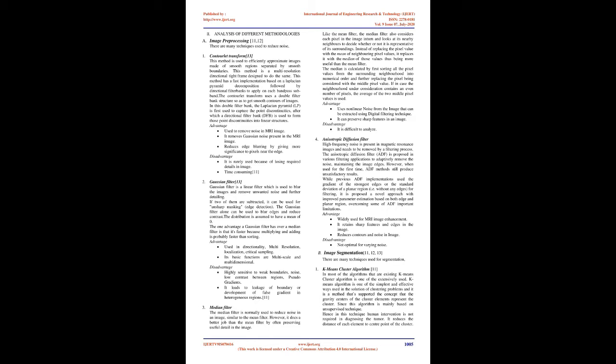Probabilistic neural network is most often used, and it is a feed-forward neural network. It is employed in analysis and pattern recognition. The statistical approach is done using ANN. To classify the detected tumor according to its malignancy level is done by the SVM algorithm. The SVM algorithm is a better approach than KNN and other algorithms, and gives better accuracy. The limitations of neural networks can be overcome by the SVM algorithm, and the combination of SVM with different neural networks gives the best result in classification.